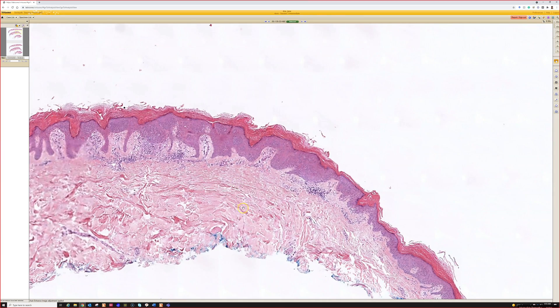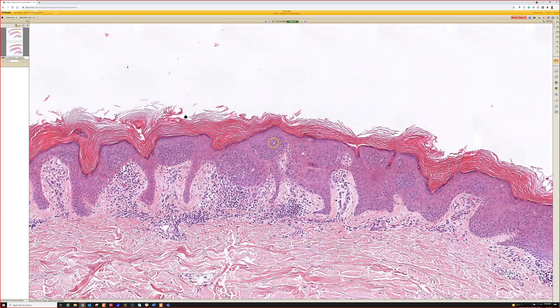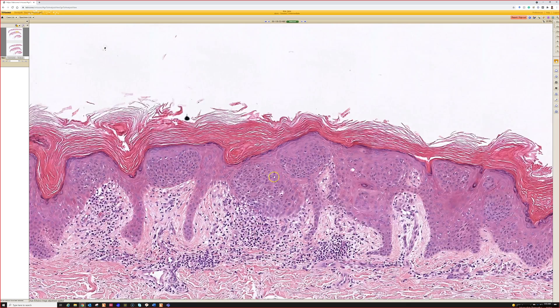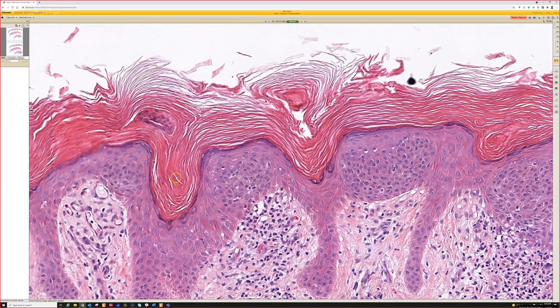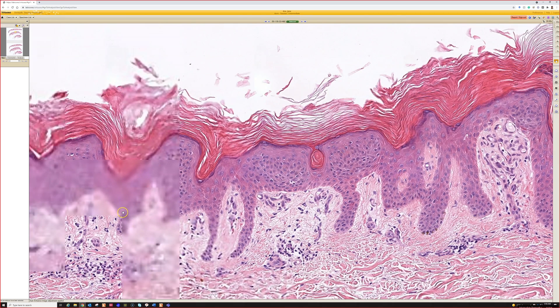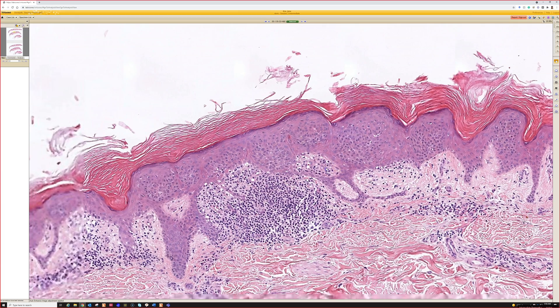This is similar to what we looked at earlier. It's got these kind of rounded nests, kind of like that first case I showed you of the clonal-looking Bowen's disease or squamous in situ, but these are very bland and in the background things look very much like a seborrheic keratosis. So this is a clonal seborrheic keratosis.